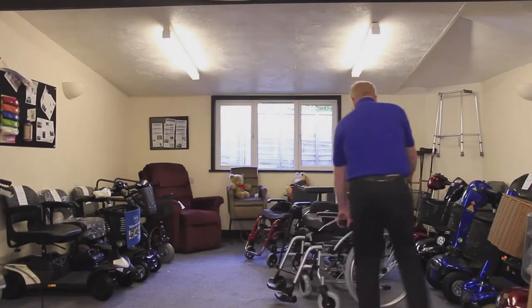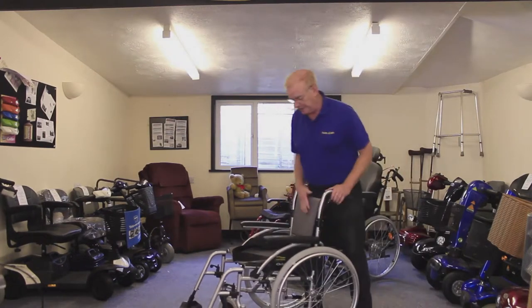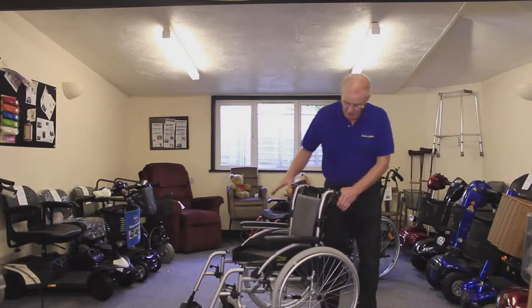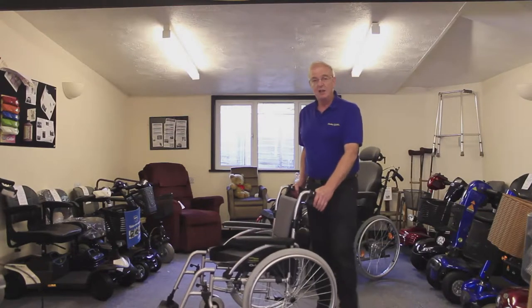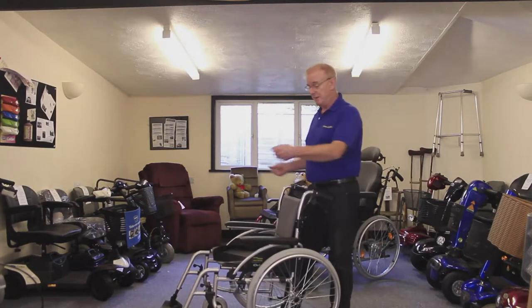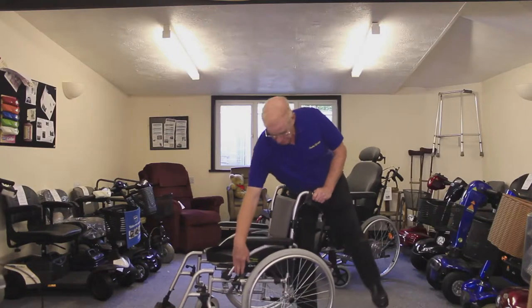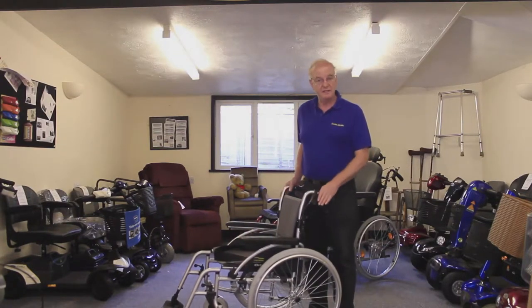The next chair is the self-propelling chair — self-explanatory, the person can propel it themselves. This particular chair has brakes that the person can operate, but it also has brakes at the back, which means it serves both purposes. If the person in the chair has some mobility and wants to maneuver themselves around they can do so, they can also put the brakes on, but if they need help being pushed that is still available.